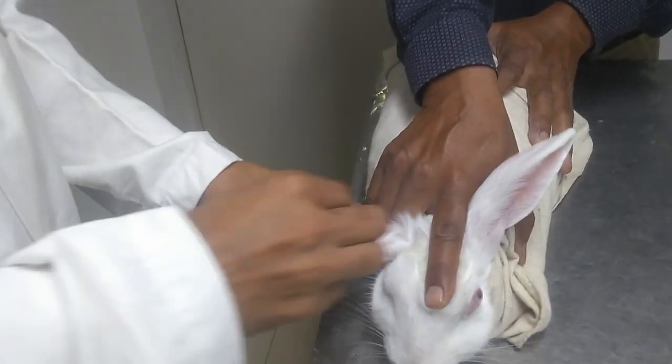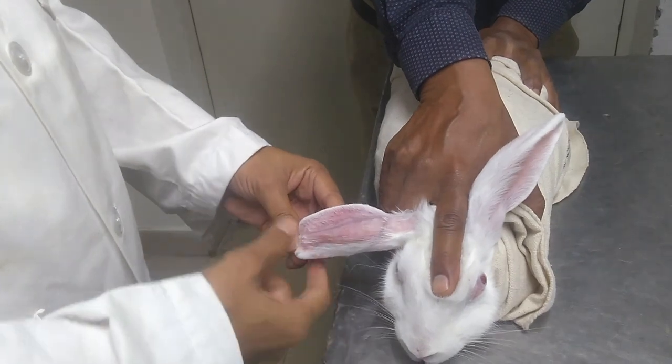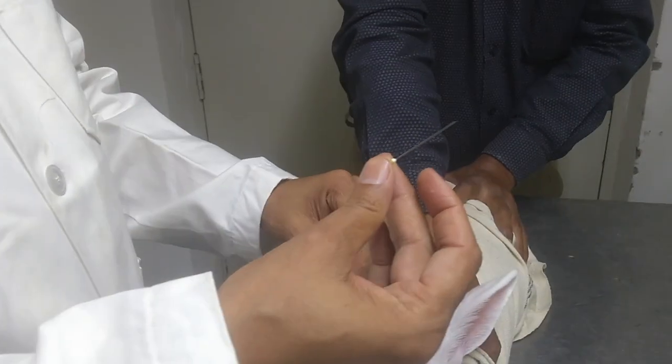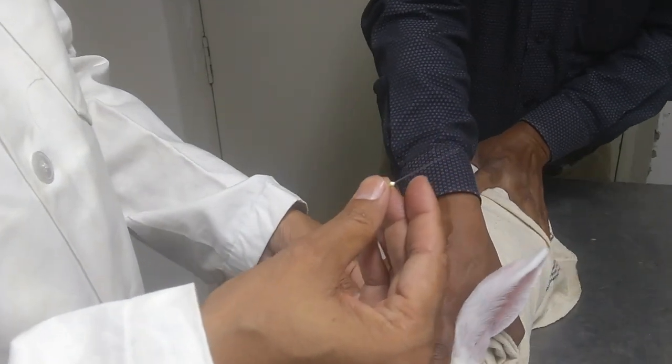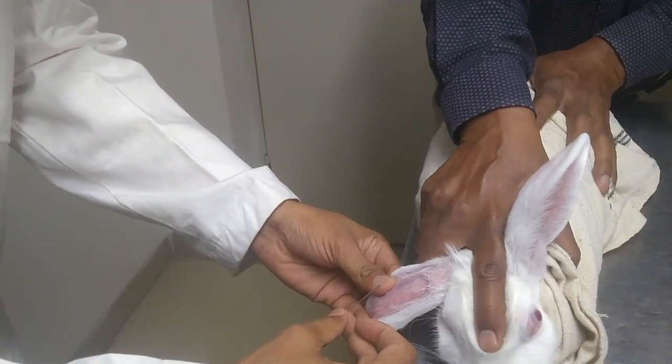We will slightly sterilize it using alcohol, and using a 20 gauge needle, which is wide enough to give sufficient bleed, we'll tip the vein and collect the blood.